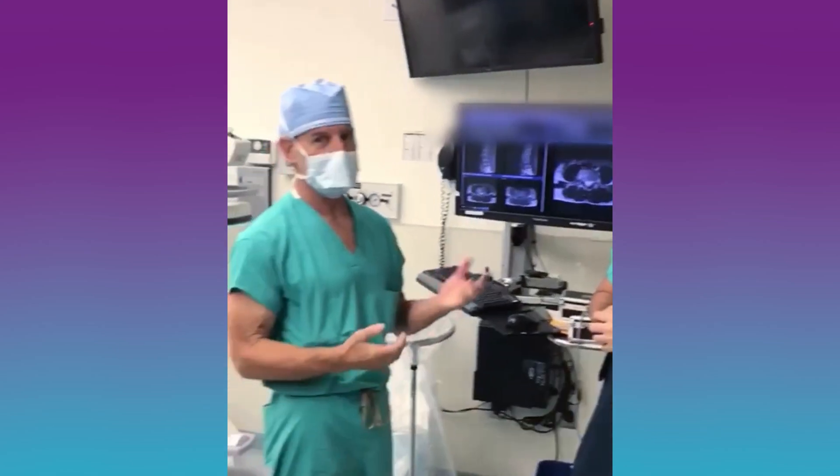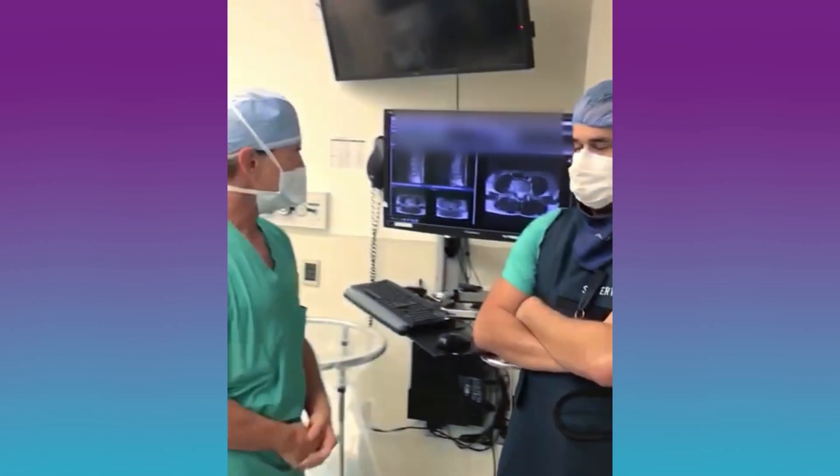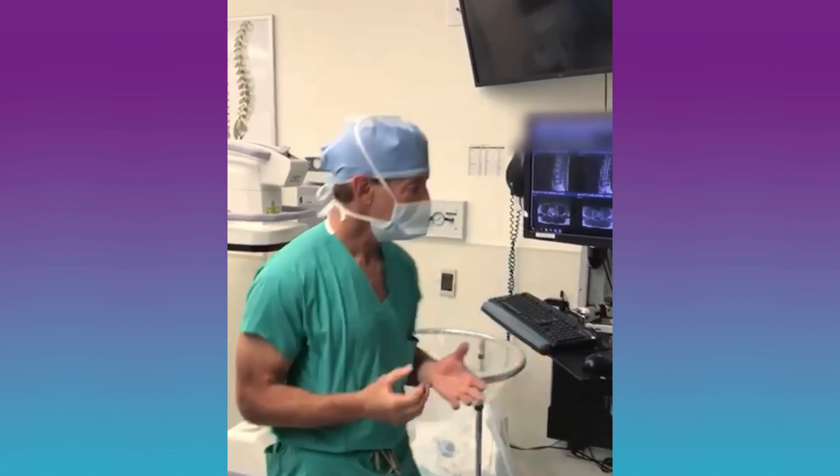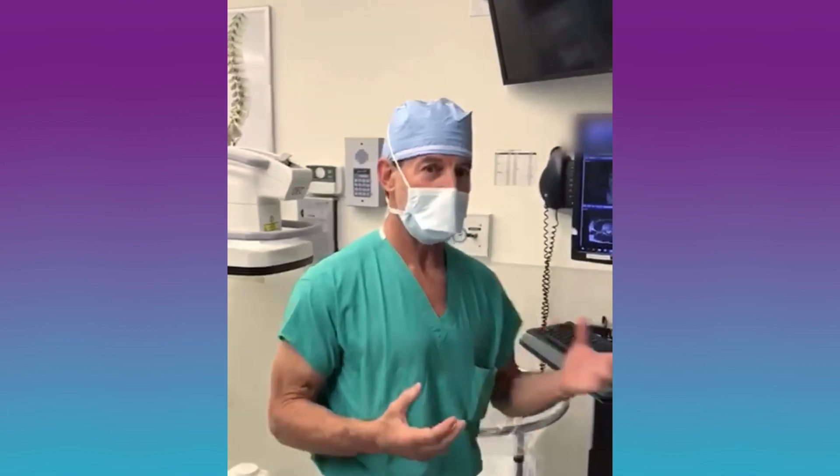Good morning, I'm Dr. Kaner and this is Dr. Gertrida. We're going to do something today that's actually probably never been done before — a procedure designed to fix both leg pain and back pain.